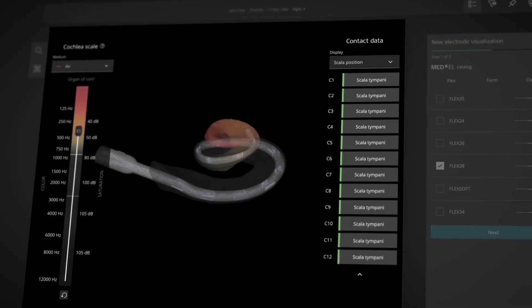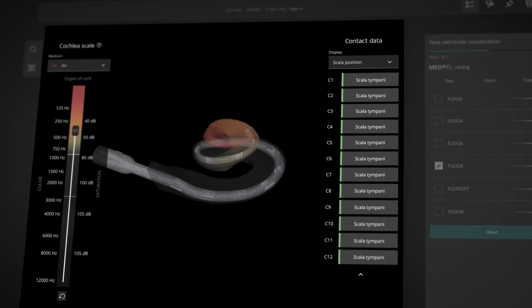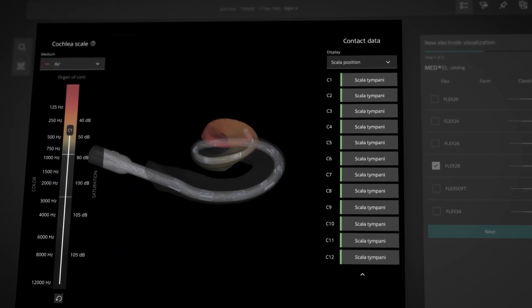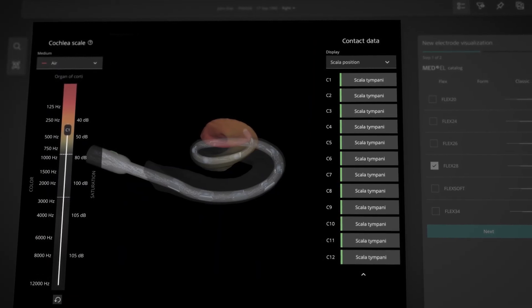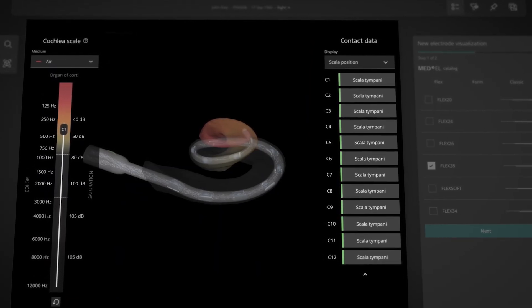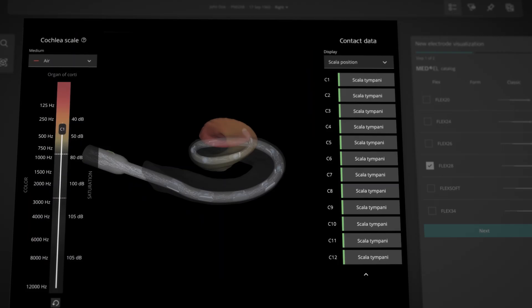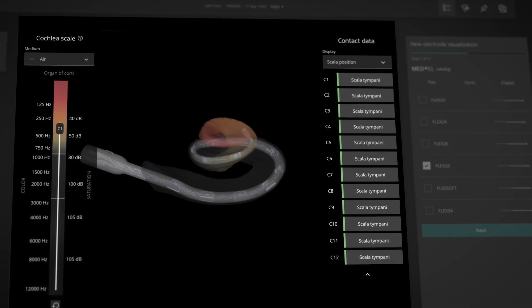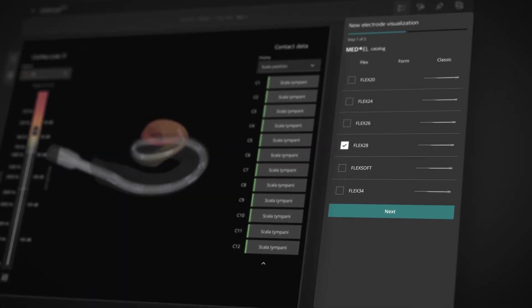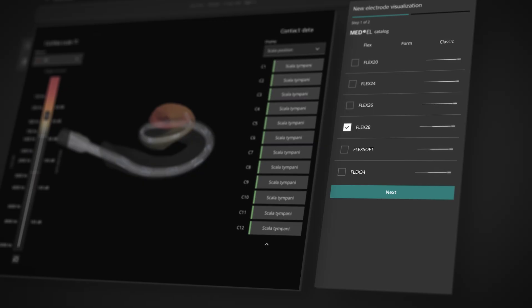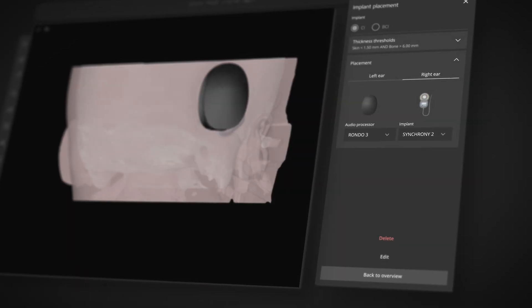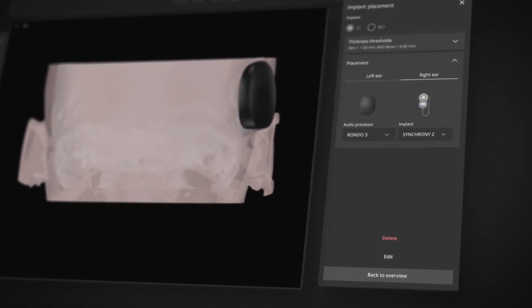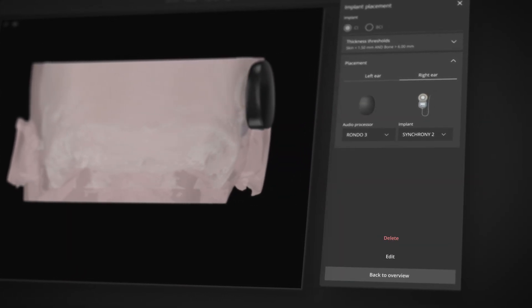You can also estimate and confirm the scala-tympani placement of each of the contacts, allowing you to visualize the optimal electrode fit in the apical region. Then you can choose the most suitable electrode for your patient and optimize implant housing and audio processor placement.